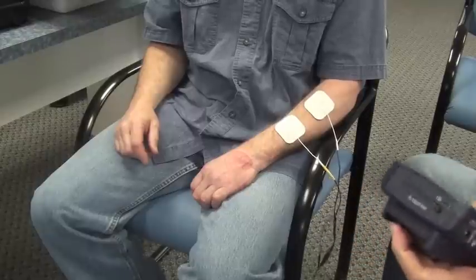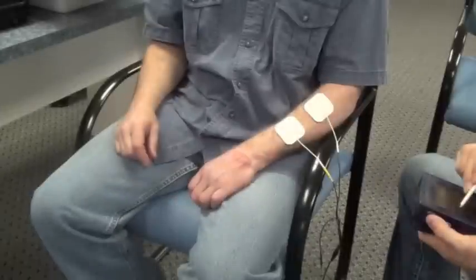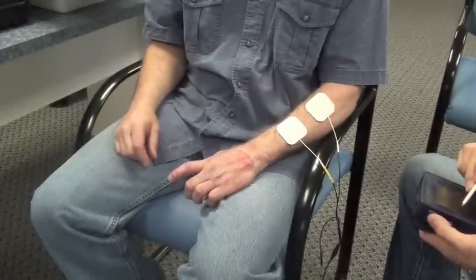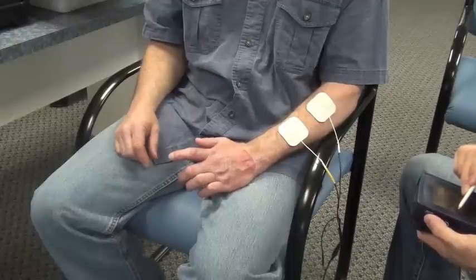Once you do this, you'll turn on the unit and determine the appropriate milliamps. At this point, you will increase the current being delivered to the wrist and finger extensors until you get a suitable motor response.